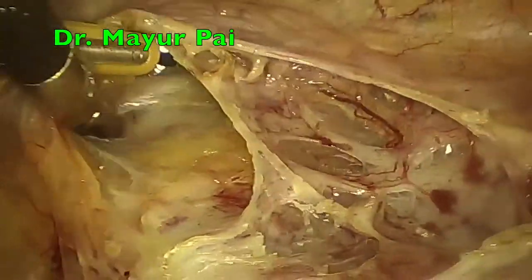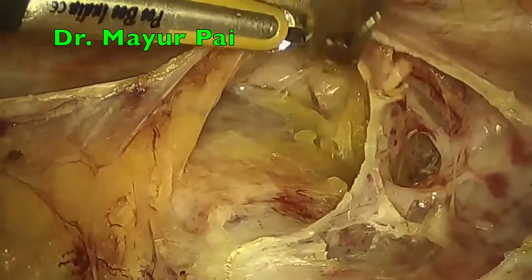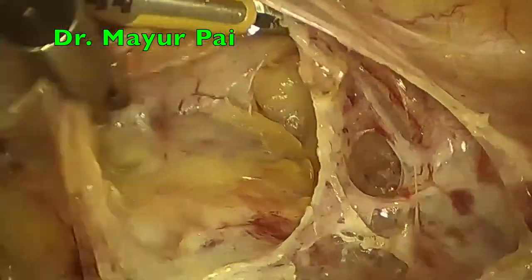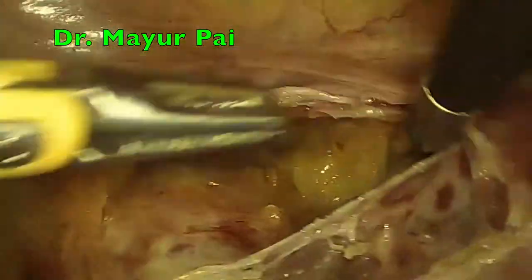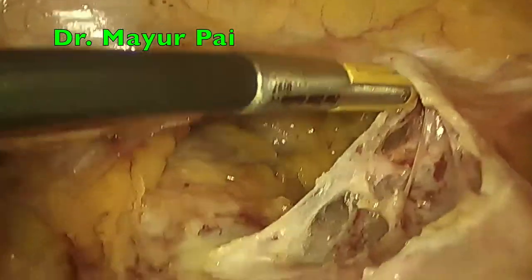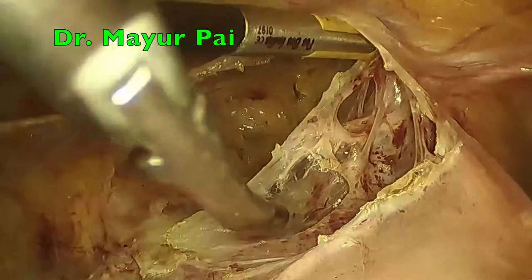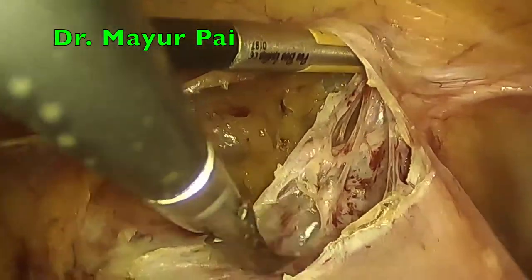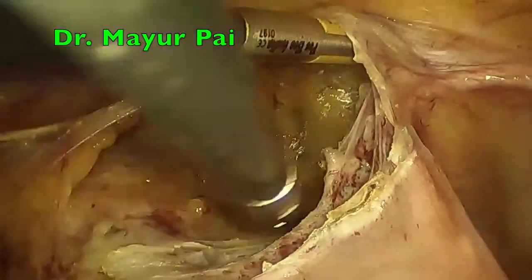Another thing to remember over here is that the yellow color fat that you see belongs to the bladder and always should be above your instruments. As you pull the bladder up with one hand and push the remaining stuff downwards, more and more tissue planes open up. Sometimes minor adhesions, which may be seen due to LSCS or any other reason, may require to be cut, as mentioned before.